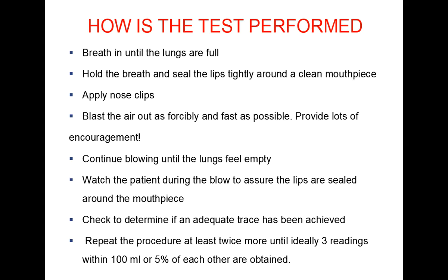Continue blowing until the lungs feel empty. Watch the patient during the blow to ensure lips are sealed around the mouthpiece. Check to determine if an adequate blow has been achieved. Repeat the procedure at least twice or more until ideally the three values are within 100 ml or 5% of each other.